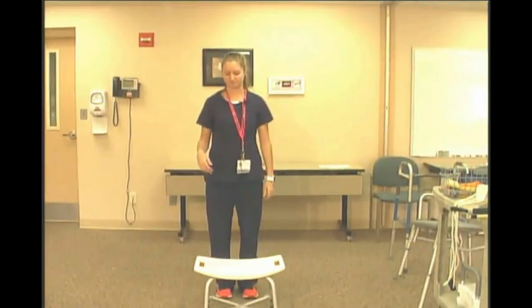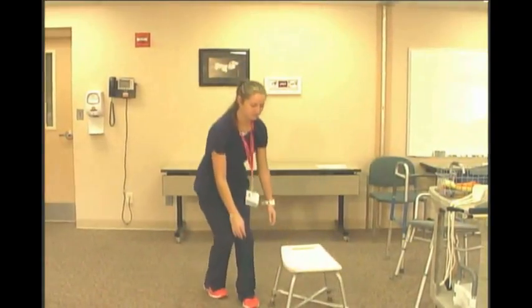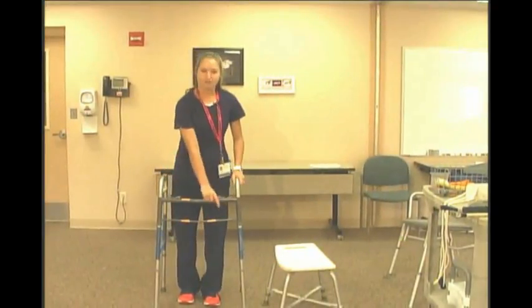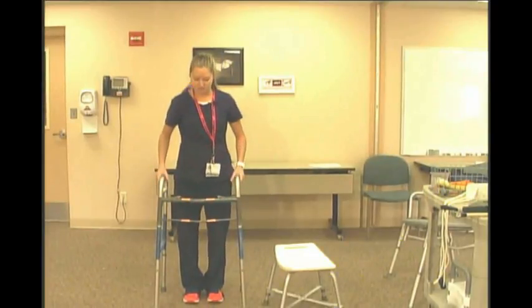They come with or without a backrest. If you have good trunk support and you don't need that extra support in back, I highly recommend going without one. I think it just makes it a little more complicated for using it, and it tends to push you into a forward position. So if you're using a walk-in shower, this would be inside. And then most people with a walk-in shower have a little lip they need to step over, usually about 4 inches or so, give or take.